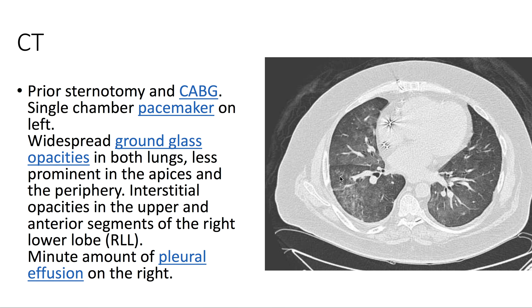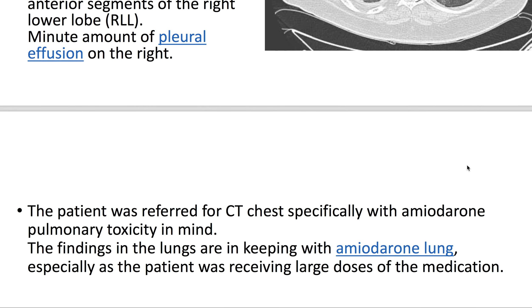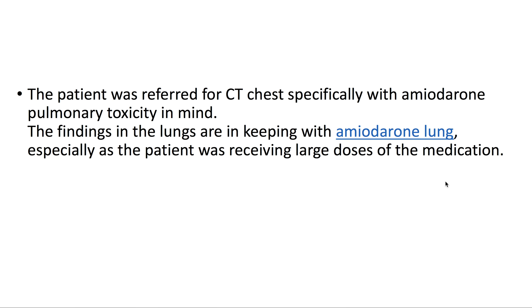On CT, we see that there's widespread ground glass opacities in both lungs. The patient was referred to CT chest specifically with amiodarone pulmonary toxicity in mind. The findings in the lungs are in keeping with amiodarone lung, especially as the patient was receiving large doses of the medication.